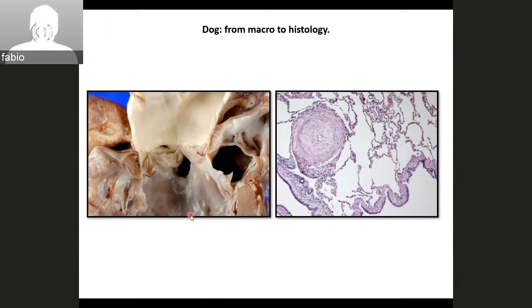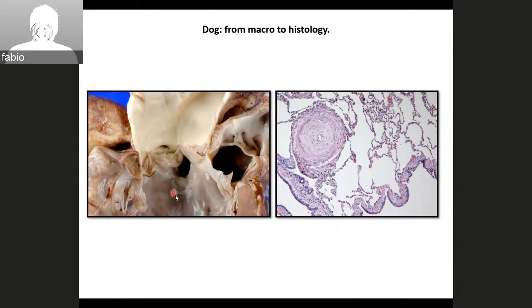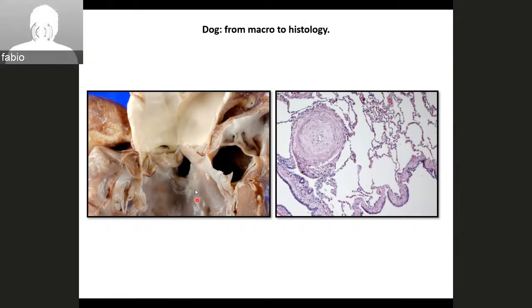Okay. And is there anything else they need to describe on this picture, I think? For the macro, no, for me it's enough. Of course, take care because around there is some kind of whitish, irregular thickening. They are all jet impact proliferation. That's for the turbulence of the blood, of course.